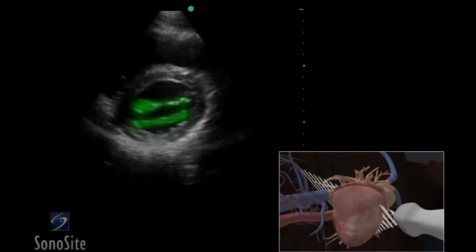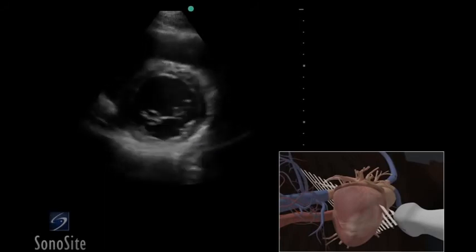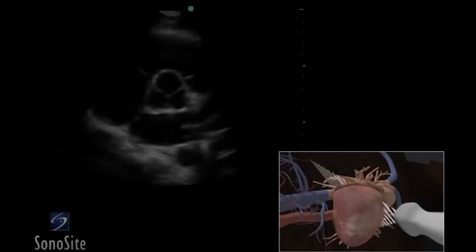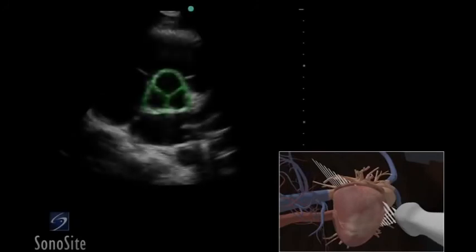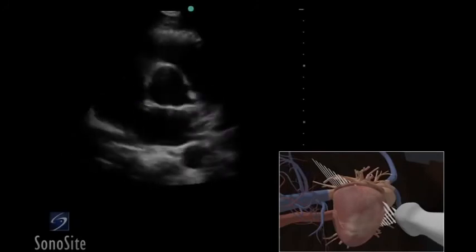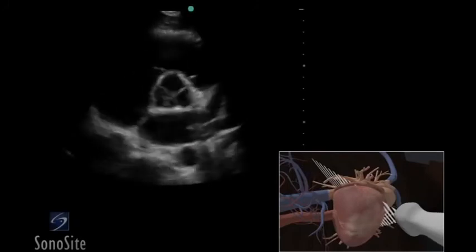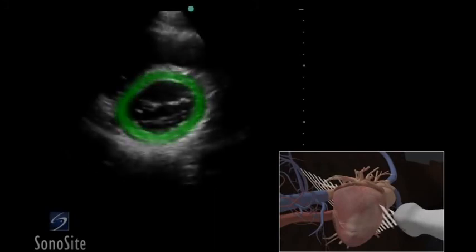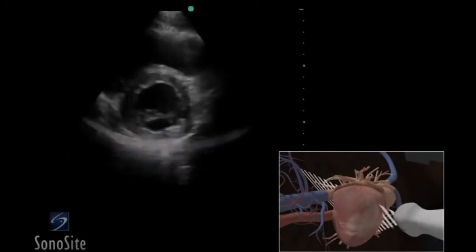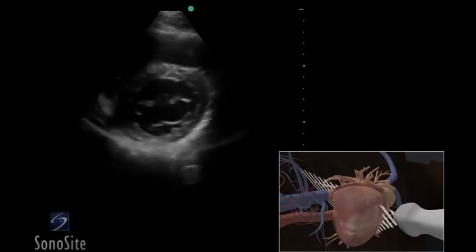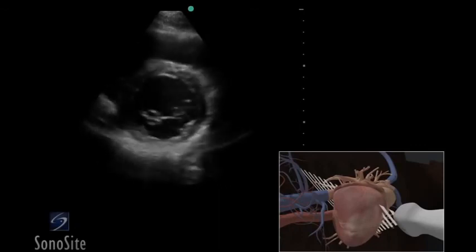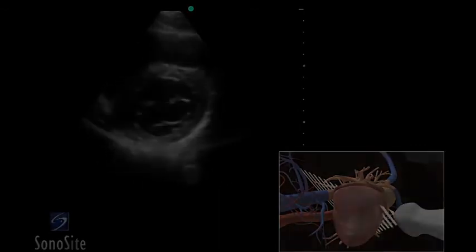The mitral valve will be seen in cross-section. From this position, the transducer can be tilted upward to visualize the aortic valve in cross-section and downward to visualize the myocardium of the left ventricle. Note the wall motion of the myocardial segments and function of the valves.